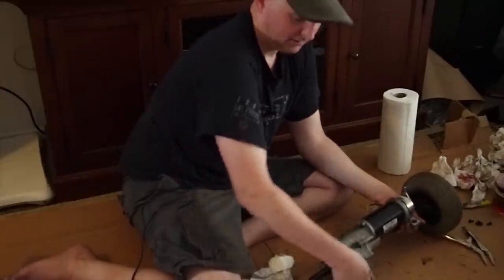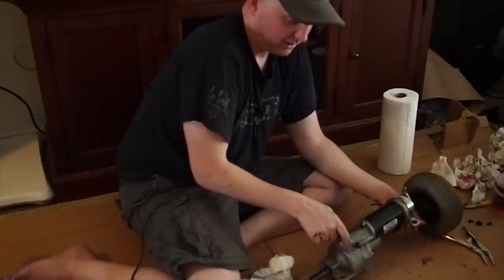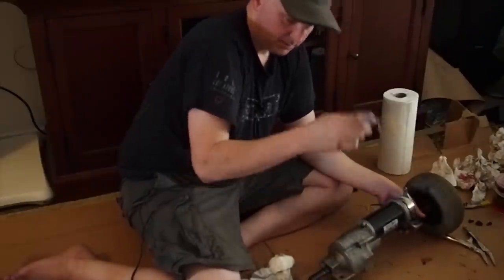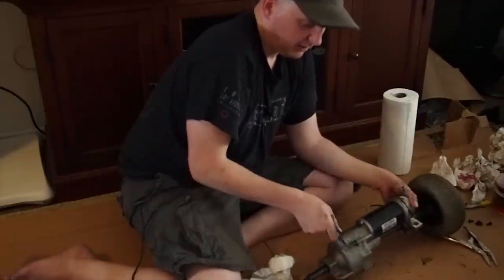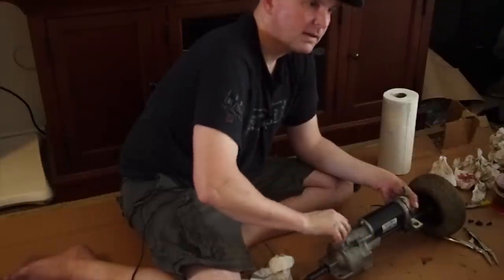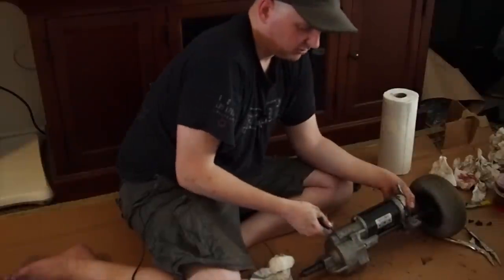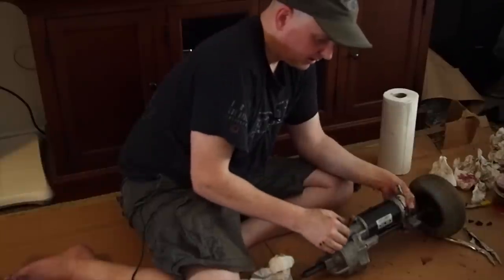Hopefully I didn't create a problem, because if you put a transmission or transaxle together improperly, the gears aren't lined up right, and you could be putting a lot of stress on the tip of a tooth instead of deep into it. I think in this case I didn't change much. I did change a little bit about how the gears sit together, so I'm not exactly sure how much pressure I'm putting on what part of the gear.